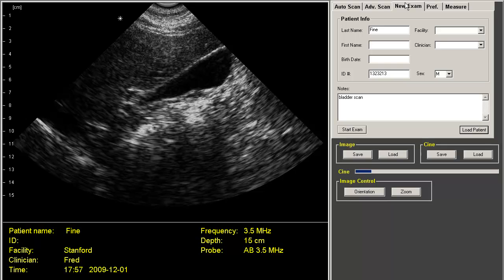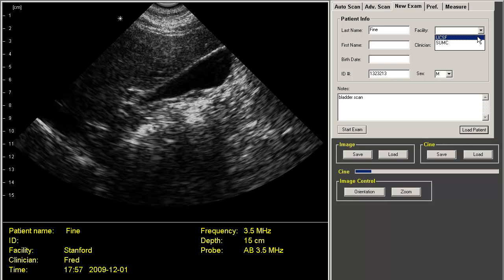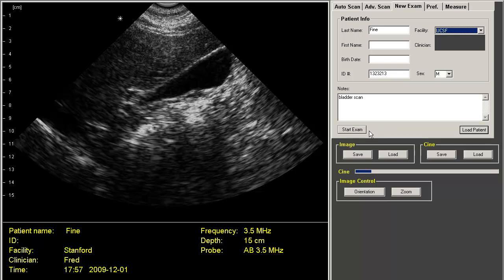The new exam tab allows you to put in the patient name and other demographic information, including notes. And you can use presets, so when you move from facility to facility or different clinicians scan, you don't have to type it in each time — you can just use the preset. When you're ready to start scanning, just click on Start Exam. It will create a patient folder with the name you've input. Make sure to click Stop Exam after you're finished scanning, so you'll close the study.